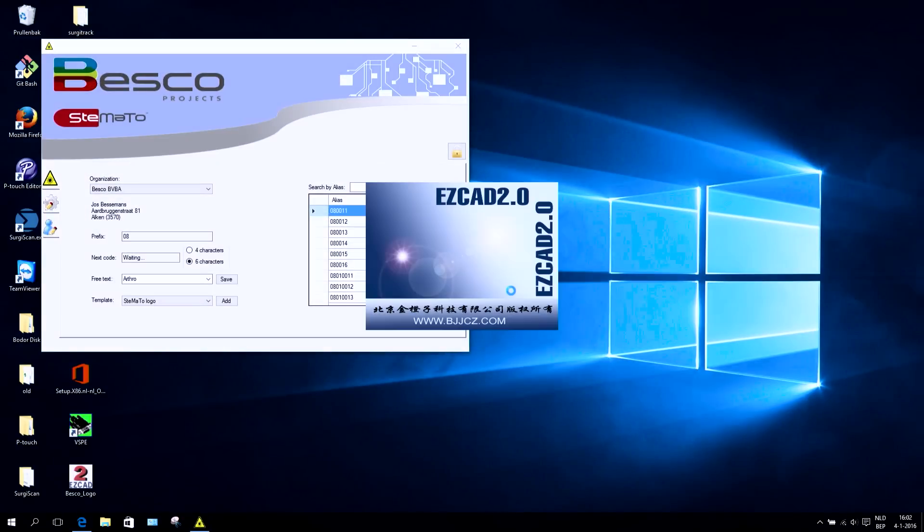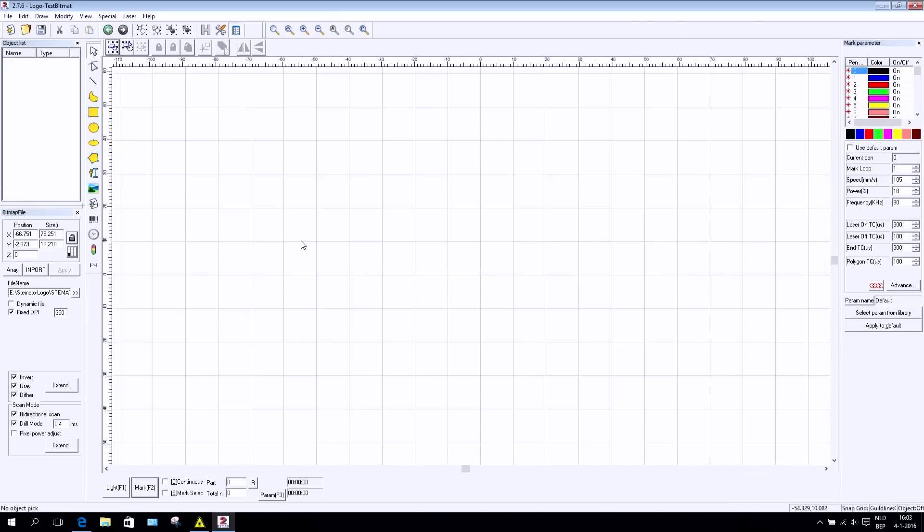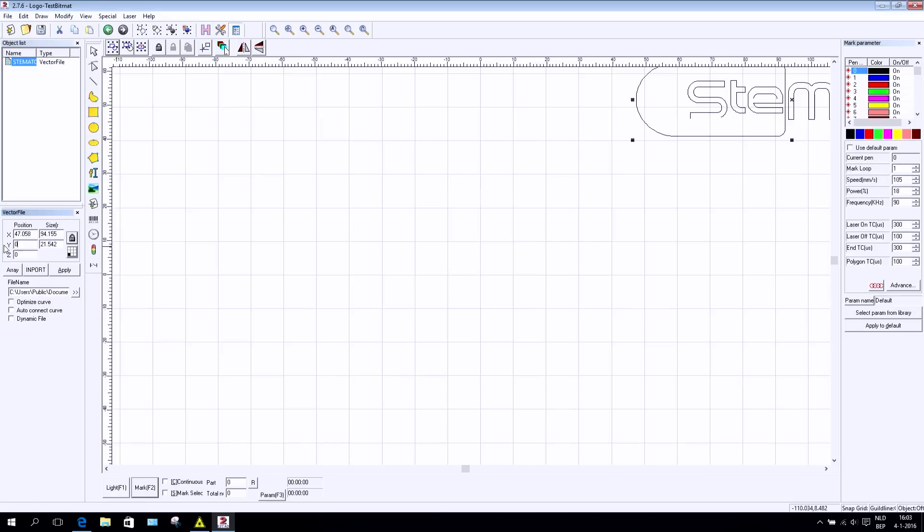The EasyCAD graphical software is used to create your templates and to control the parameters for the laser.